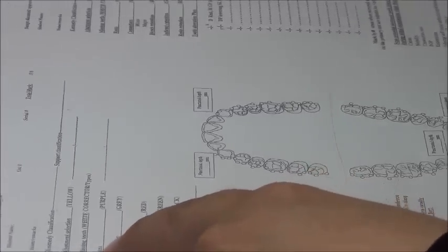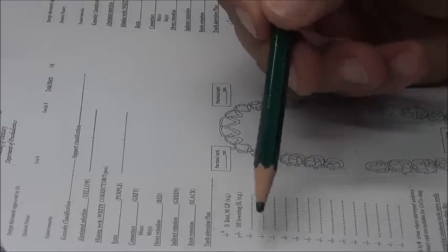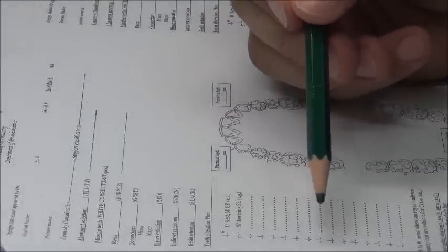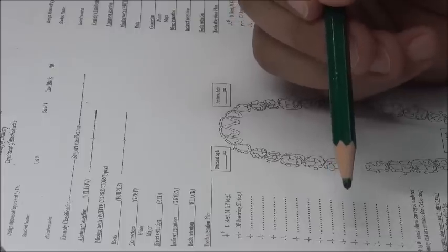Rests are very important to write down. Why? Because we need to know where we're going to place our rests, and rests are not only on abutment teeth; there are extra rests sometimes that we add, so we need to write down the teeth that get rests. When you write down teeth that will contain a rest, you remind yourself that you should write it down in the tooth preparation plan, because in that section we are planning the teeth preparation.